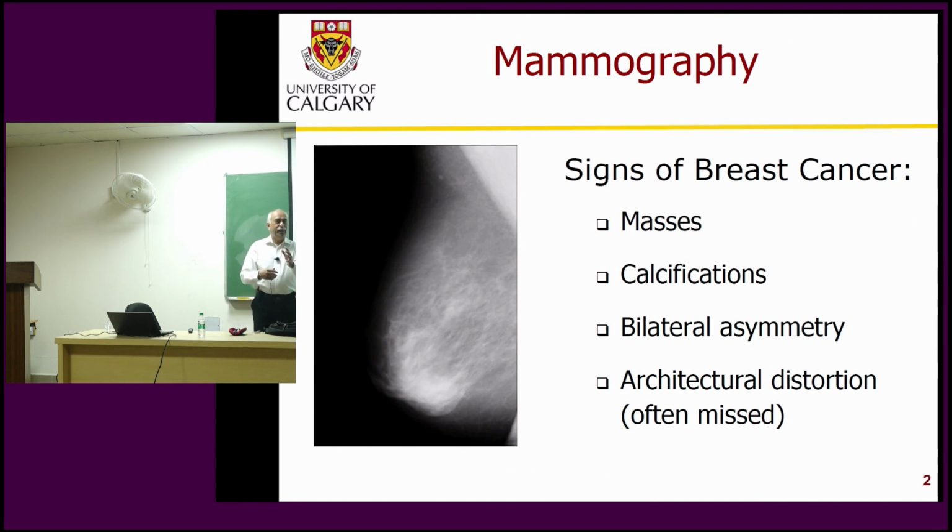Now the same thing came later on. Mammography was accepted fine, and then CAD came. And in CAD also we have false positives. Every system will have some false positives. So again, the concern was, well, we have a program that's running and women have come in and programs are running well. They need a certain portion of the population to participate in the program in order for it to be effective for the general public. If nobody participates, then the field will not develop any further. So a certain portion of the population should come and get this done.